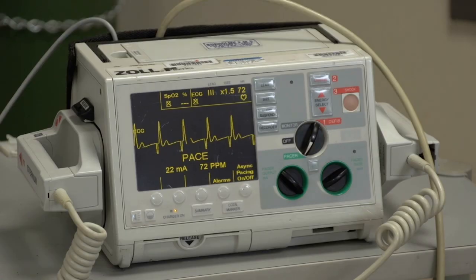Check the rhythm on the monitor. If the rhythm remains ventricular fibrillation or pulseless ventricular tachycardia, do 2 minutes of CPR and shock again. Increase the energy to the maximum energy level.